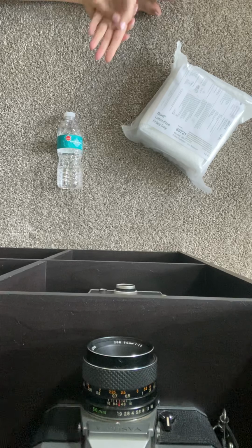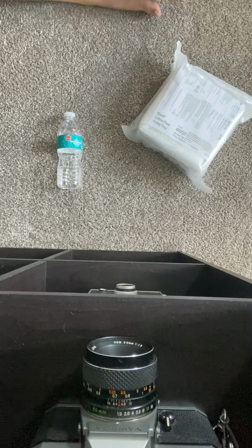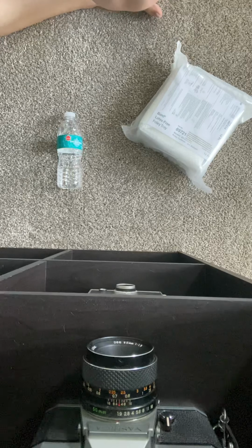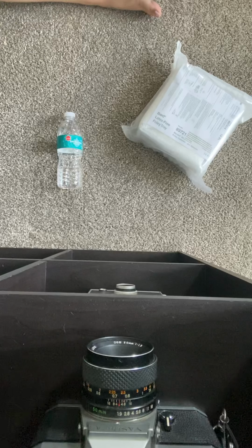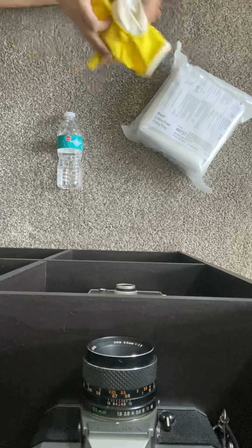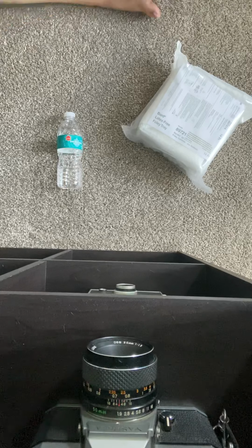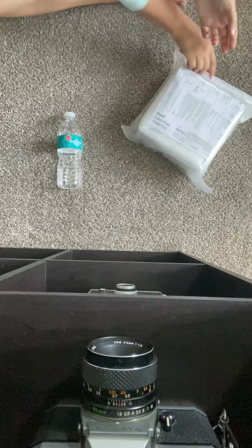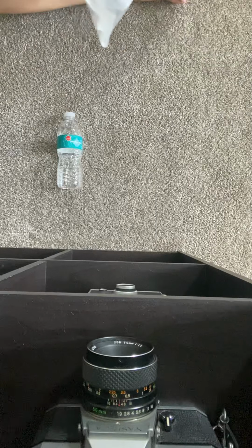I should have gloves on. Actually, I do. I'm not even going to put these on, because you should have regular gloves on. Obviously, that's a given. So anyway, I'm going to start opening my kit here.